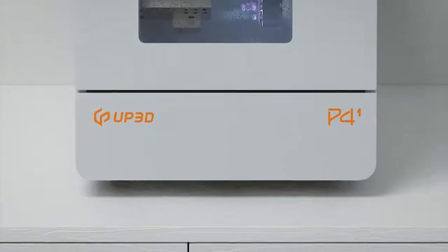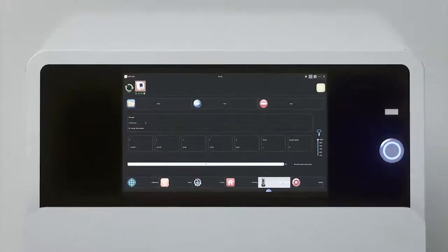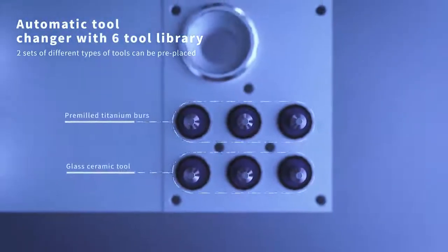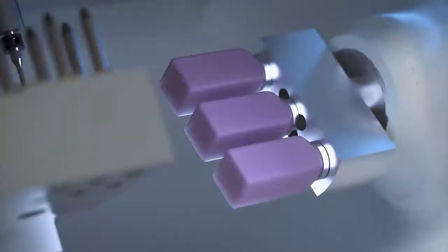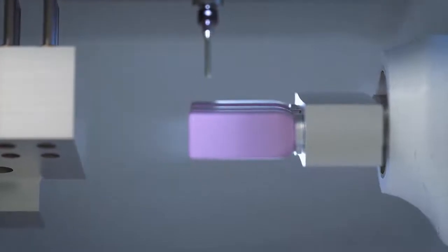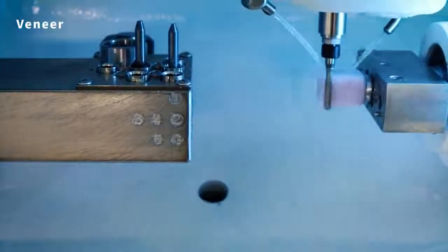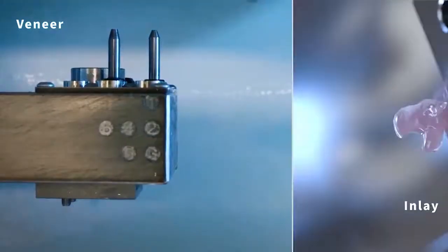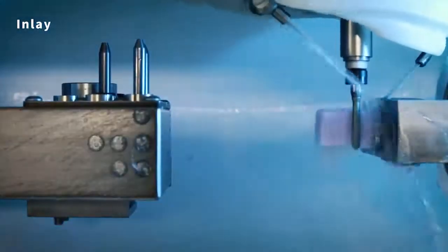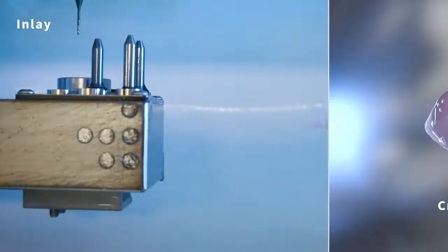P41 is a 4-axis wet dental mill. It features an intelligent automatic tool changer, which can replace two sets of bars of glass ceramic and premium titanium blanks at the same time without changing bars manually, improving production efficiency. It supports grinding of multiple materials across a wide range of restorations, including crown, inlay, veneer, and implant abutments.